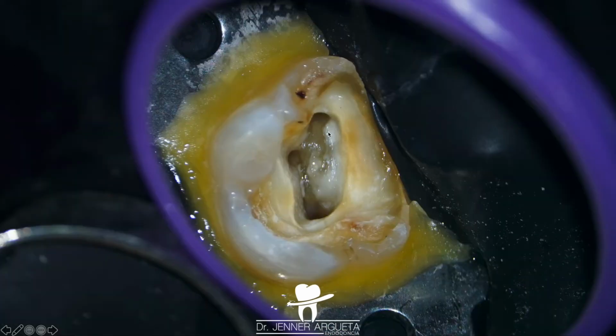As you can see now, after removing some dentin, we might have some idea of where the MB2 might be located. We still have calcifications here, but these calcifications are strongly attached to the pulp chamber floor, and they are not going to interfere in our root canal treatment, so we can just leave the calcifications.